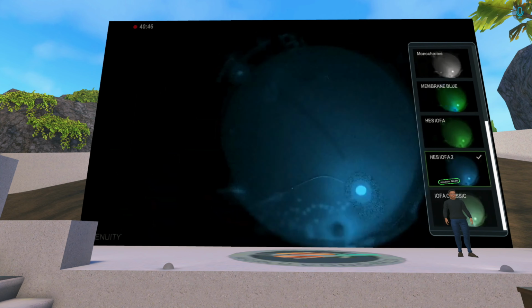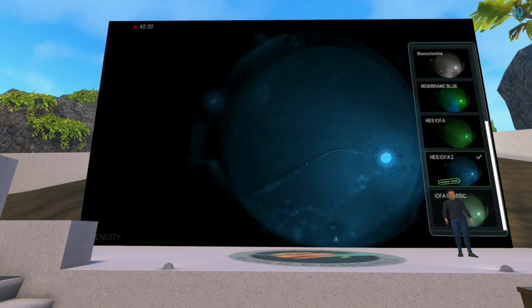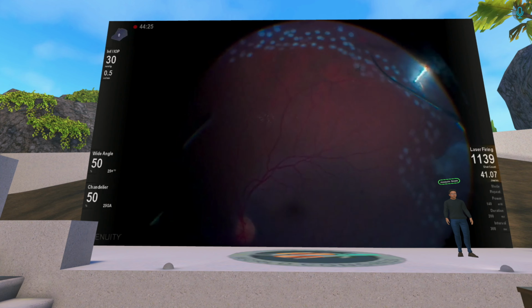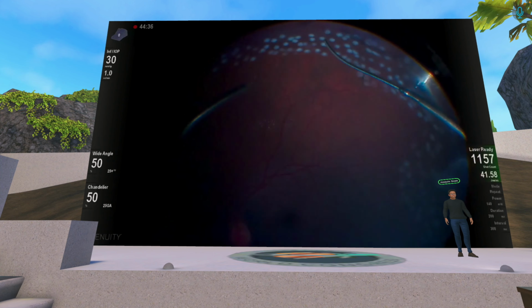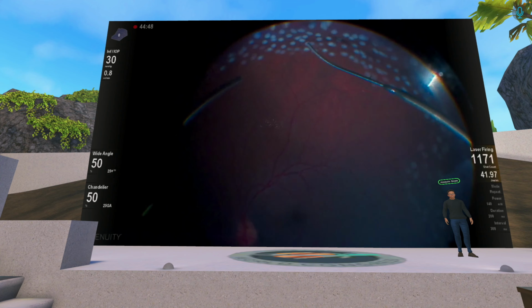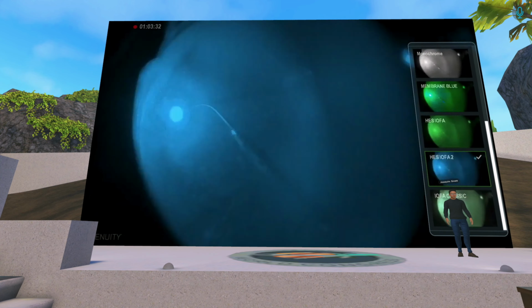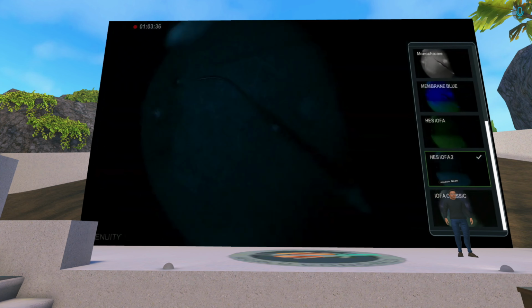In the advanced settings, I believe saturation like 40. And that's all. I don't remember exactly the parameters. I could share it later on. Yeah, no worries.